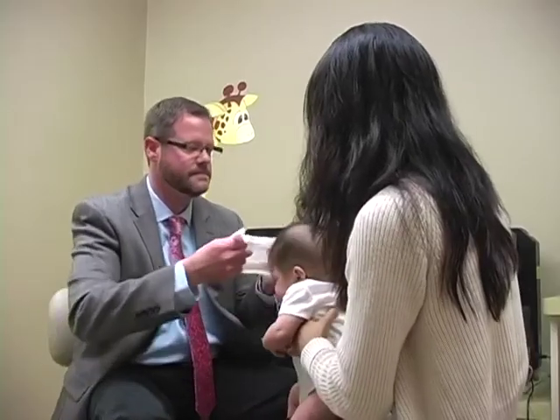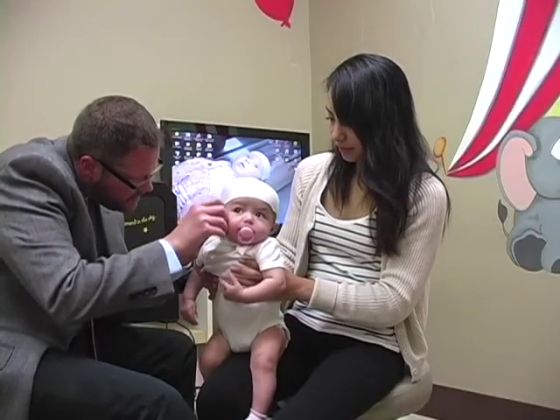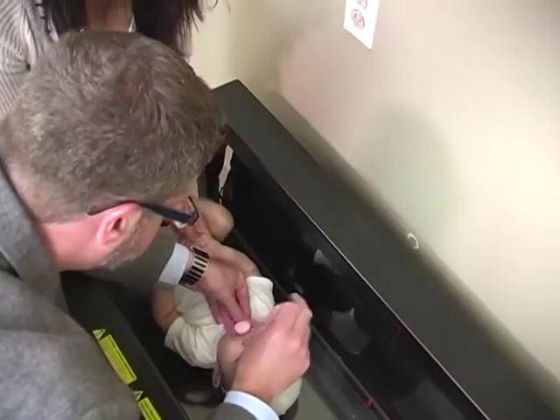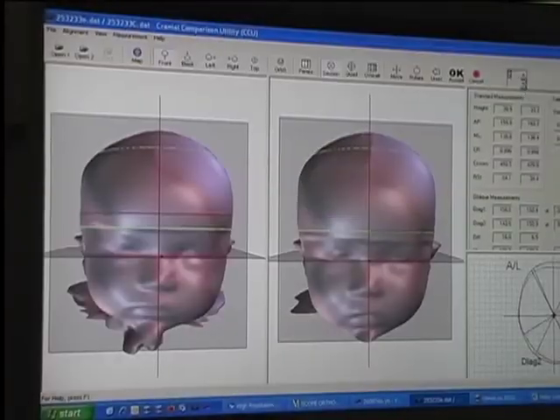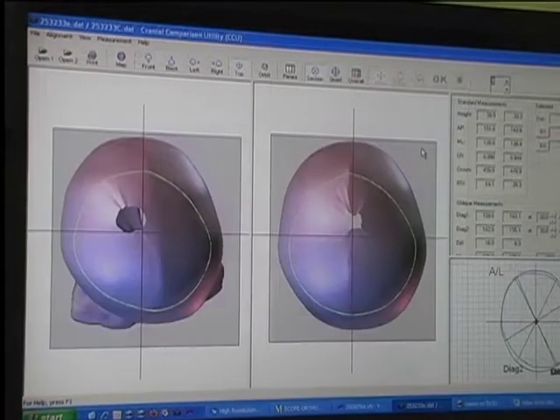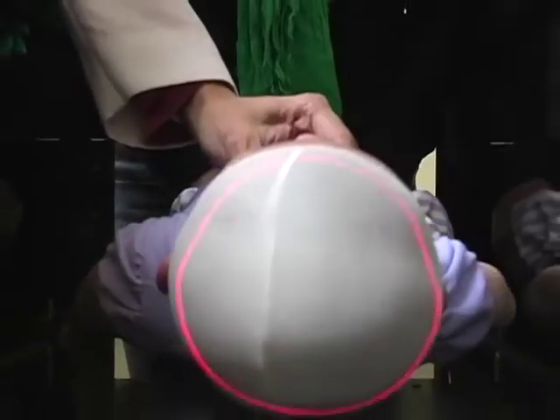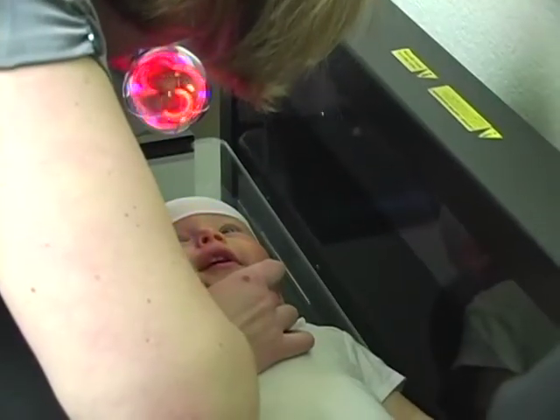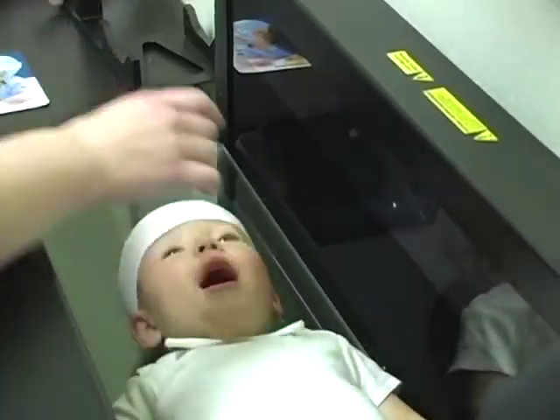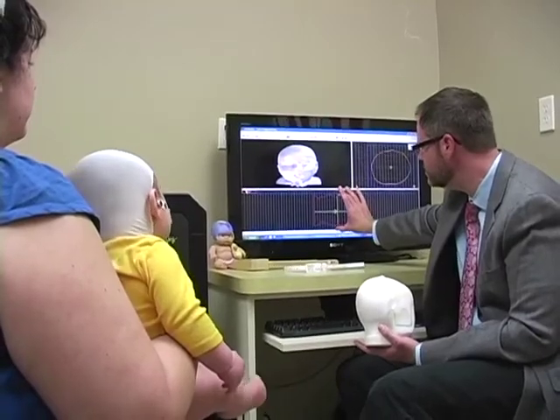To begin the scanning process, a stockinette is placed over the child's head and markers are placed at the ears. The stockinette holds down the child's hair and allows the scanner to take a smooth, accurate image of the cranium. The markers at the ears help practitioners to consistently place landmarks in the scan for comparative studies during treatment. The child is then placed in the scanner with the mother holding the baby at all times, or the practitioner distracts the baby's gaze into a neutral alignment as the scanner's cameras pass by the child's head. The scan takes less than 2 seconds and is accurate up to 0.25 millimeters.